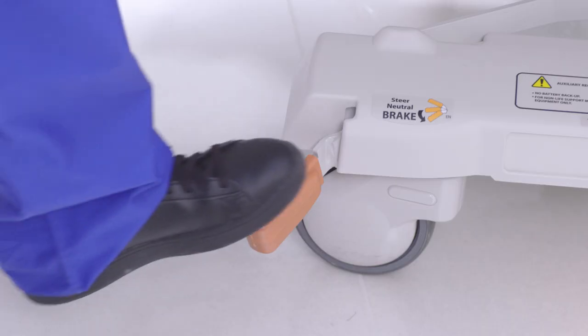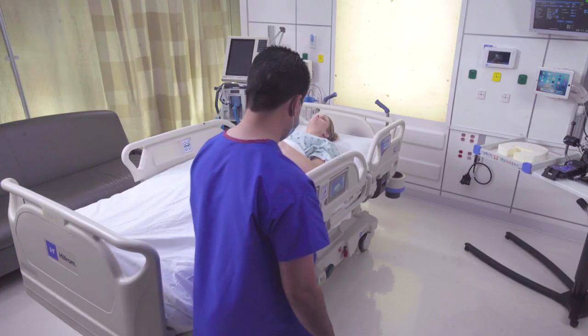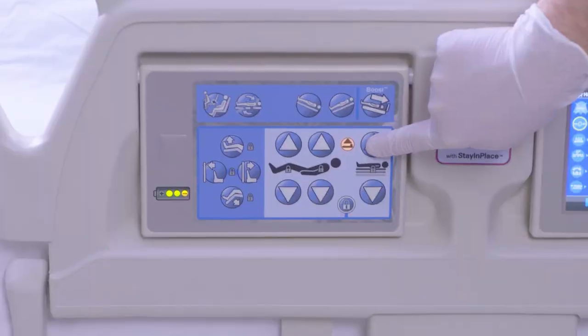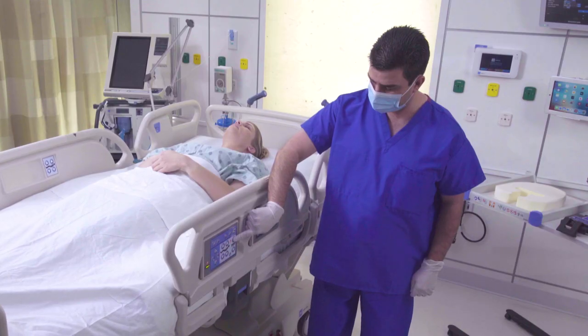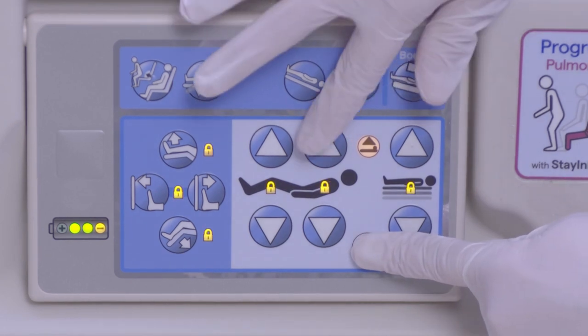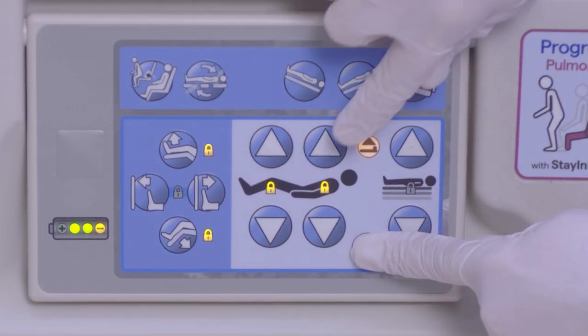Prior to installation, ensure that the brake is set, the bed is in the flat position, and at an ergonomic working position prior to handling the patient. At the caregiver controls, lock out the head and knee articulation functions.